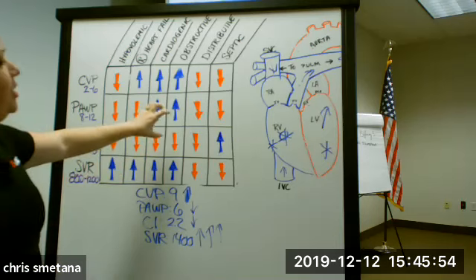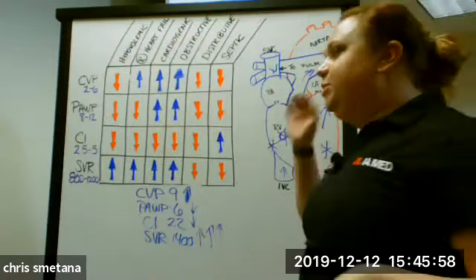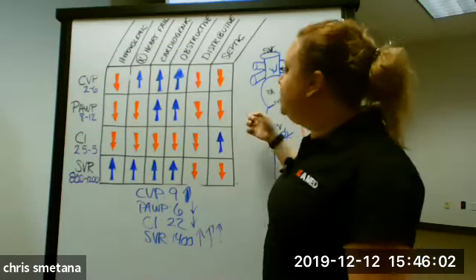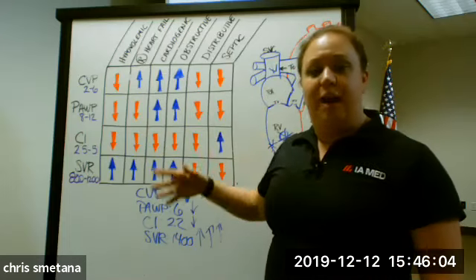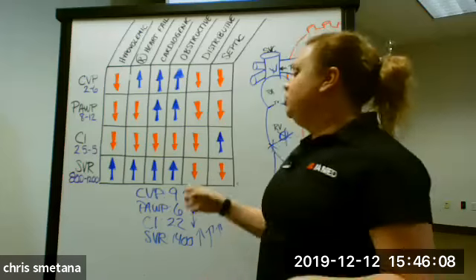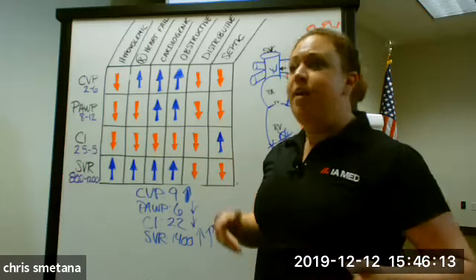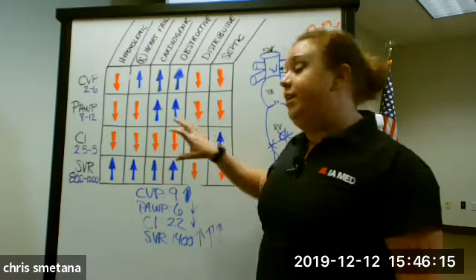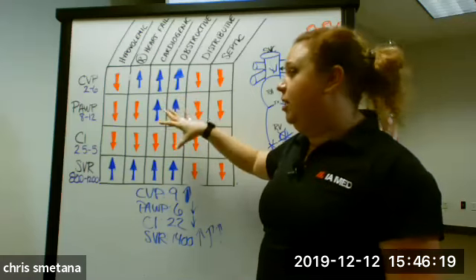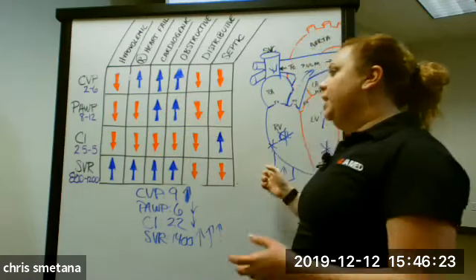Not saying that, I don't work on a CV-ICU, I do have a couple of friends who still work on CV-ICUs, or cardiovascular ICUs. They look at these numbers all the time and they actually pay attention to all of them, but that's their specialty. Okay. So if you are constantly transporting really sick cardiac patients, that's the time where you really want to go through. And if you are monitoring these, like I said, we don't typically have the option to monitor anything except for potentially a wedge pressure with some of these patients. So keep that in mind.